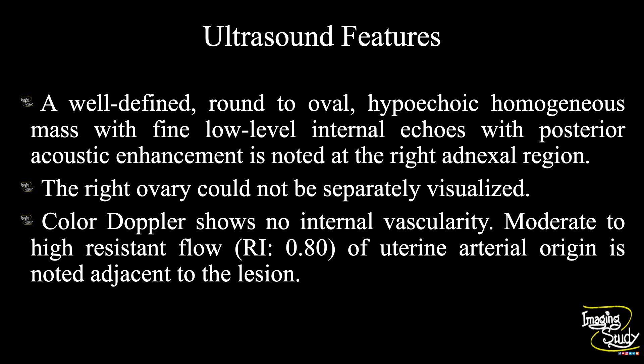Color Doppler shows no internal vascularity. Moderate to high resistant flow with an RI of 0.8 of uterine arterial origin is noted adjacent to the lesion. The diagnosis is endometrioma, or chocolate cyst.